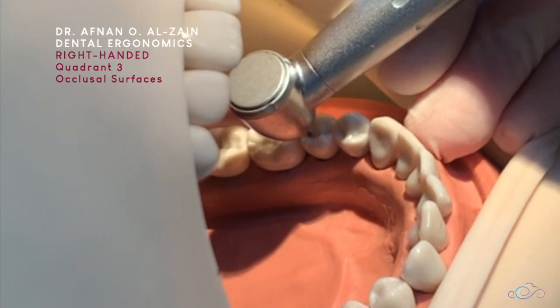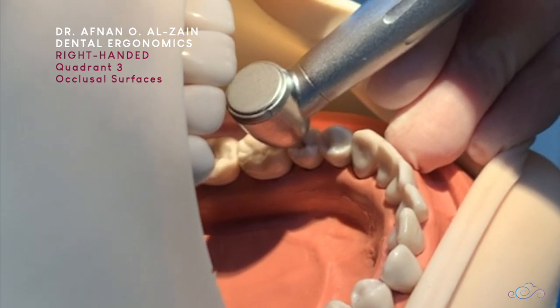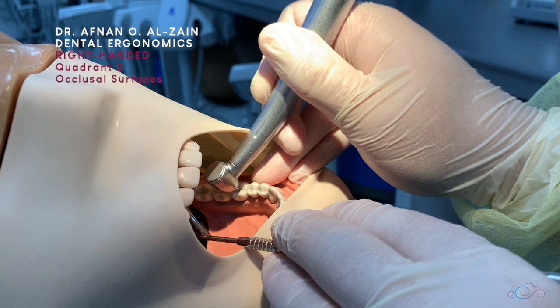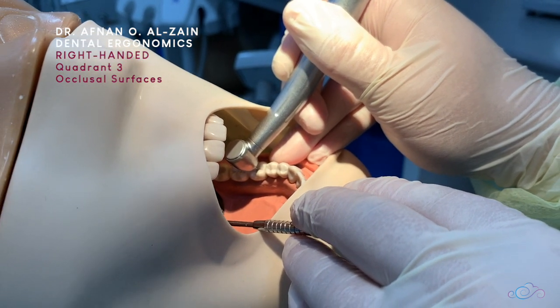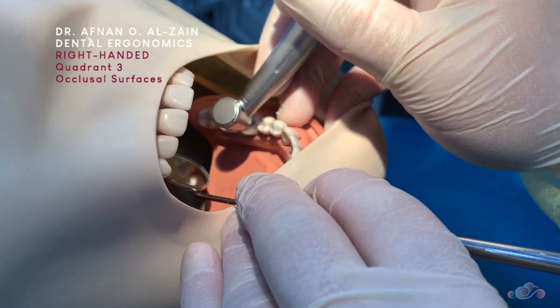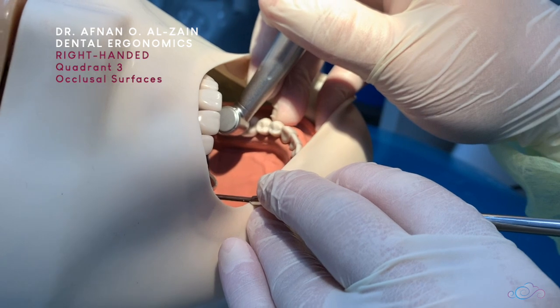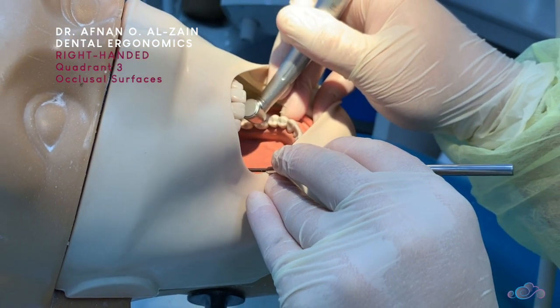If you cannot see the grooves clearly, you have to tilt the patient head a little bit until you can see properly without tilting your own head. When working on the premolars, bring your fingers a little bit forward, and the same rules apply — you have to make sure you have proper finger support. Regardless of the tooth number, use the mirror to reflect the light so you can see better, or to retract the cheek. To recap: place the handpiece perpendicular to the occlusal surface, place proper finger support, and use the mirror to reflect the light or retract the cheek.